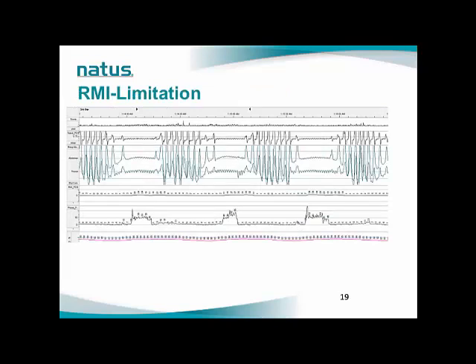In this slide, we have the snore channel, SpO2, nasal pressure, thoracoabdominal traces, phase, and RMI. Looking at the nasal pressure, it's evident that there are apneas. Thoracoabdominal effort shows absent effort throughout the apnea periods.